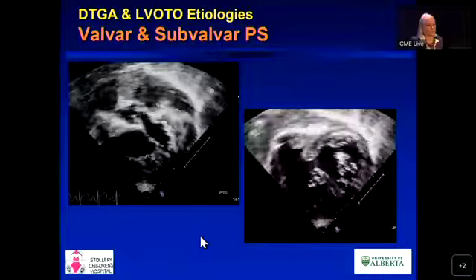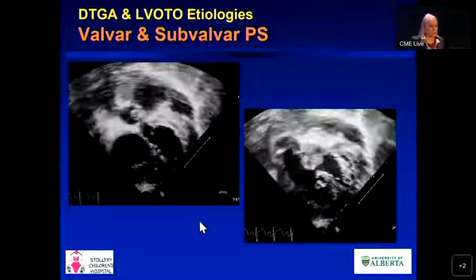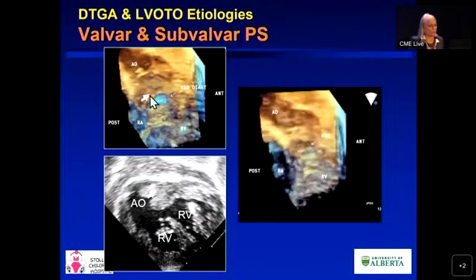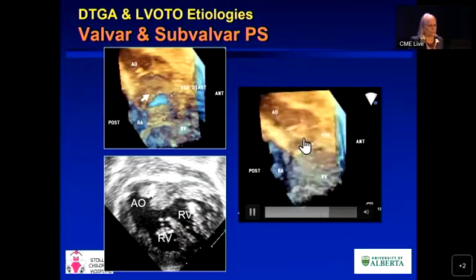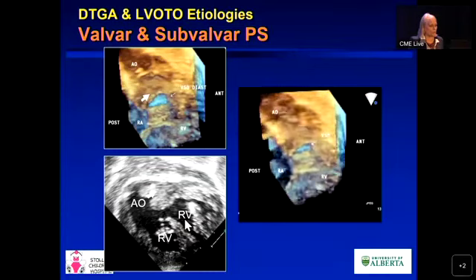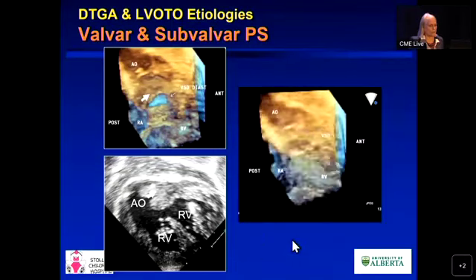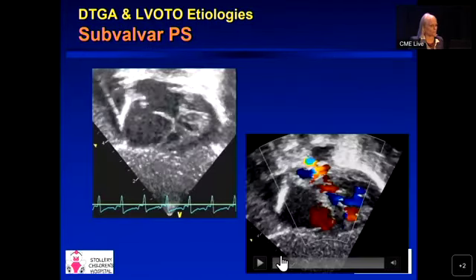Make sure the baby has a good sized atrial communication and sufficient pulmonary blood flow. Send them on their way and then bring them back. This is just the 3D of that VSD where, in that one dimension, it looked not that bad. In the other dimensions, it's quite dynamic. And so this is not one that you're going to want to rely on for a Rastelli. So that's one that we would try to send on their way and bring them back for a Nikaido at a later stage if the coronaries are sufficient.